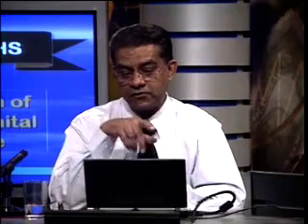Also, you should know what the clinical setting is. If you look at this type of physiology, they usually have cardiac enlargement, they have congestive heart failure, they have X-ray enlargement of the heart. So within this subgroup, if you analyze their ECG, you can have a differential diagnosis as pointed out to you.